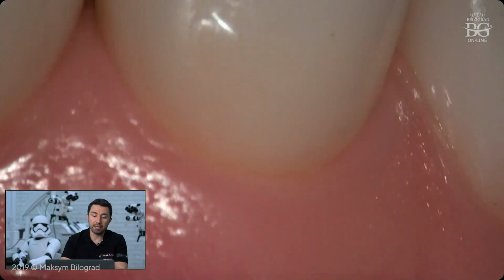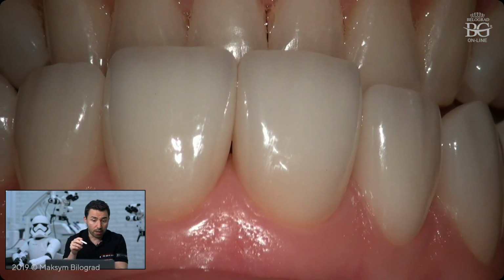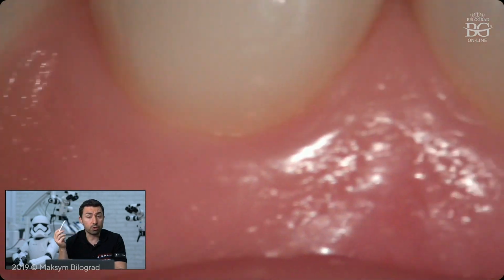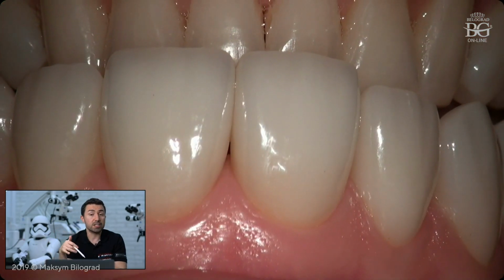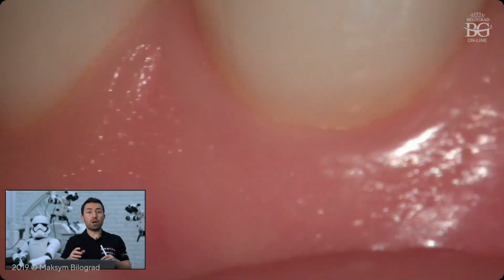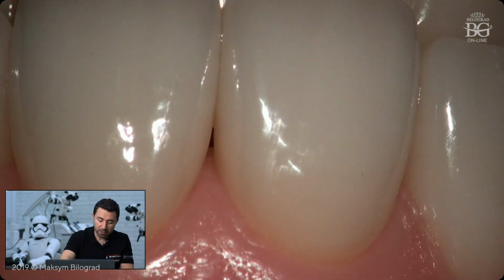This is what I would like to highlight. We made a proper consultation, we gave options to our patient, then we evaluated aesthetic components, we designed the smile, we referred this information to the dental technician, then the dental technician gave us a wax-up, we performed preparation for the upper arch utilizing porcelain veneers as the final restorative material, and we used the copy-paste technique as the hybrid restoration for posterior teeth. So that is a pretty complex case with different techniques and their combination that were based on proper aesthetic and functional treatment planning. Okay, this was the short conclusion.